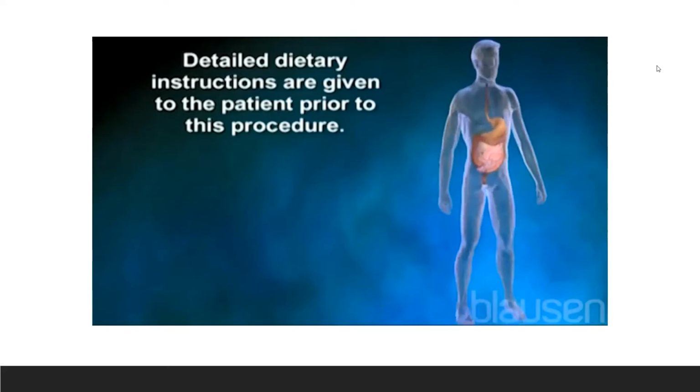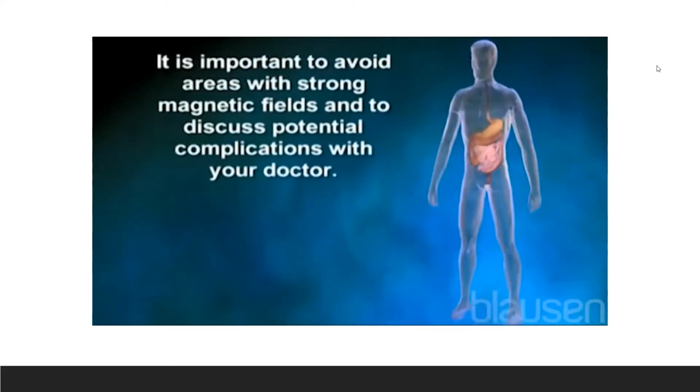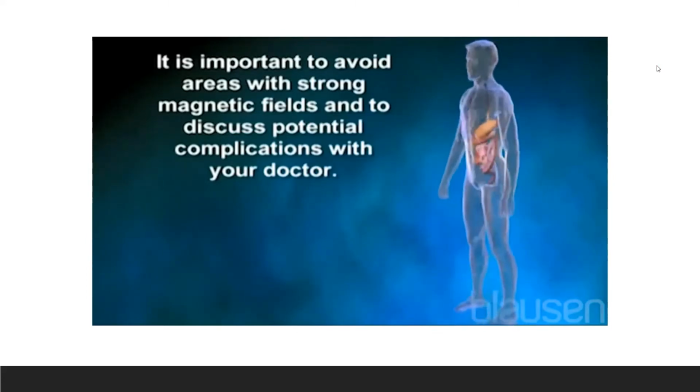Detailed dietary instructions are given to the patient prior to this procedure. It is important to avoid areas with strong magnetic fields and to discuss potential complications with your doctor.